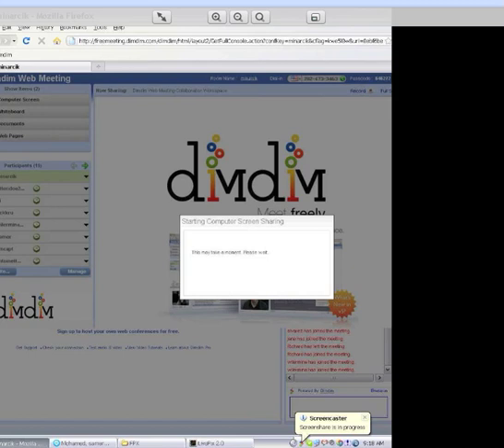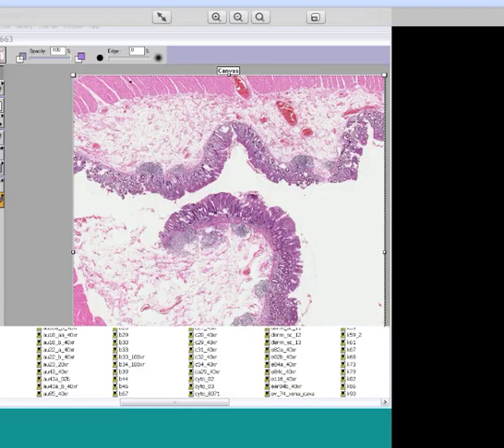I see it's kind of like a double picture, and it's gray, but you can see through it. Are you seeing the slide? I don't see a slide. No. You're seeing the slide very soon. Someone said yes. It is there.